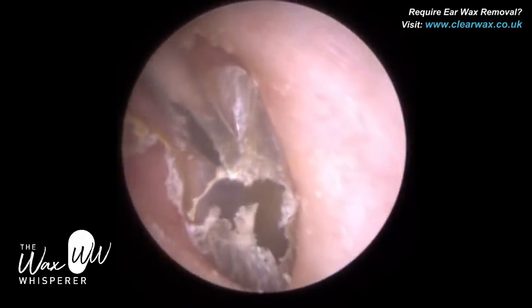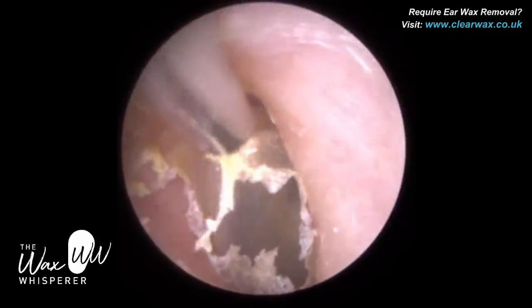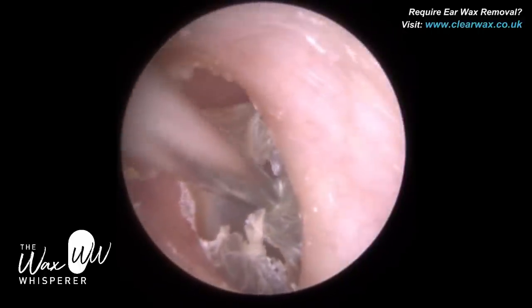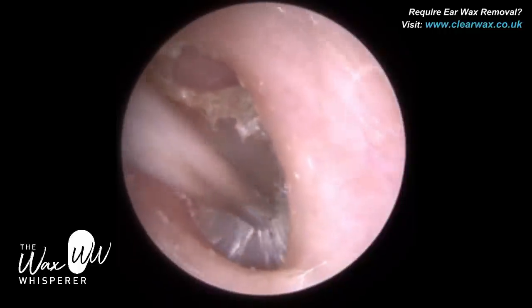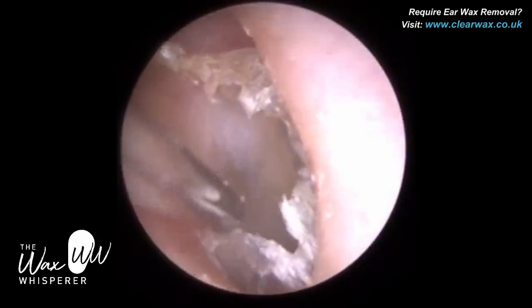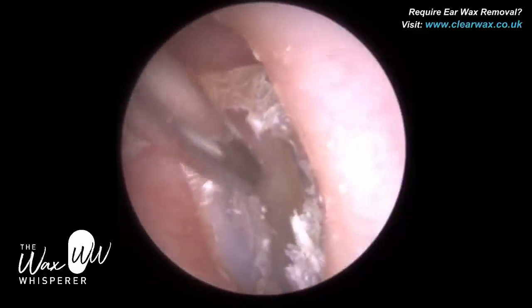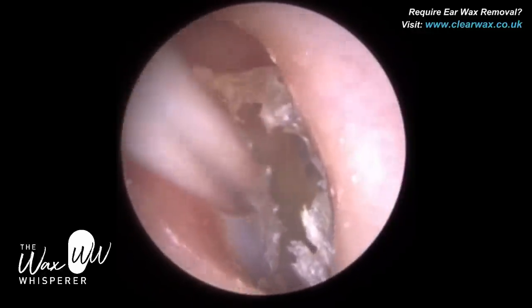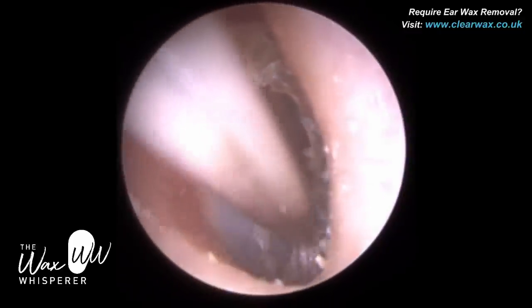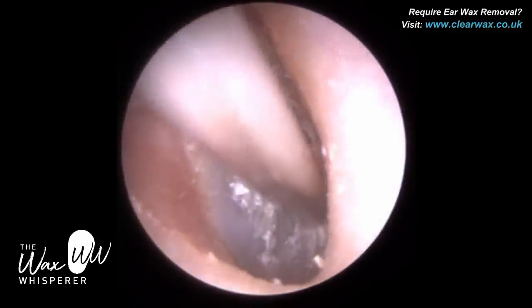The reason for this buildup is that the skin lining the eardrum also lines the inner two-thirds of the ear canal. It's a very thin layer — less than 0.1 millimeters thick. In most people, as the skin on the outer layer of the eardrum and the bony part of the ear canal sheds, it naturally migrates outwards like a conveyor belt. It's a bit like a snake skin — it sheds, dies, and migrates outwards — but in this patient the skin is migrating to where the isthmus is.